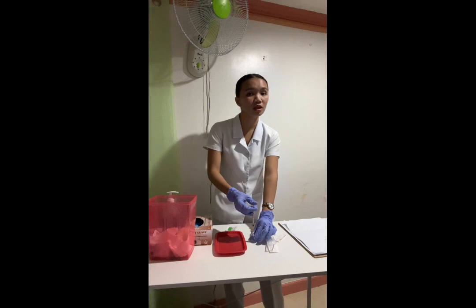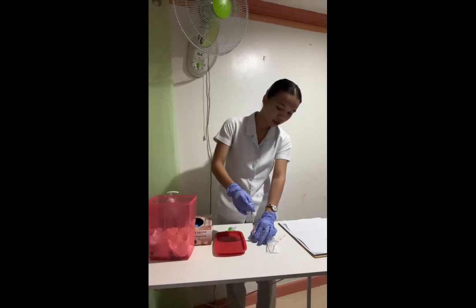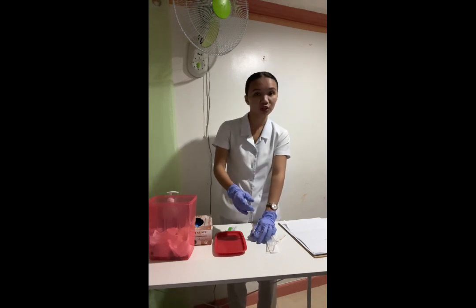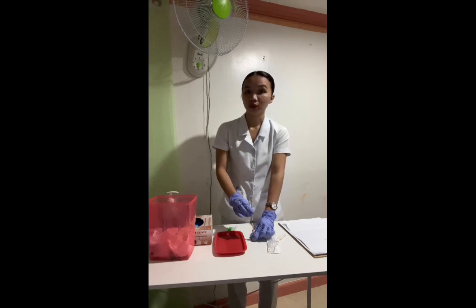Inject the air into the vial, keeping the bevel of the needle above the surface of the medication, because the air will allow the medication to be drawn out easily. Because negative pressure will not be created inside the vial, the bevel is kept above the medication to avoid creating bubbles in the medication.